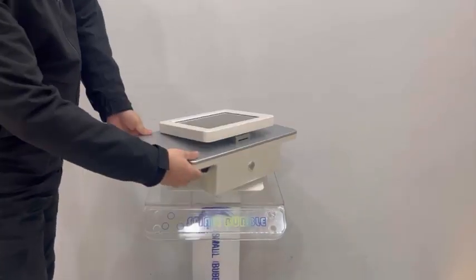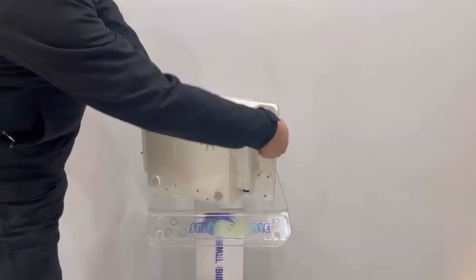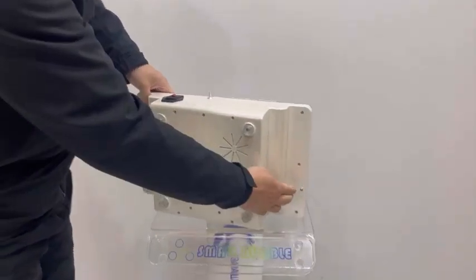Now we install the 2-in-1 HIFU BADRINO machine. First, we connect the handle holder.